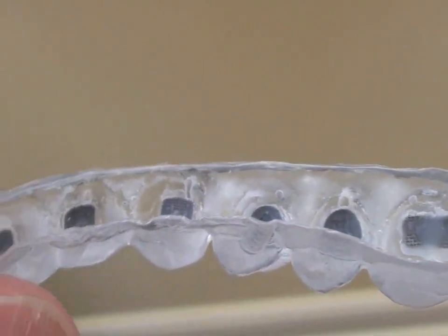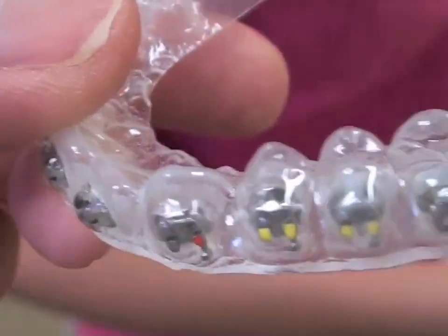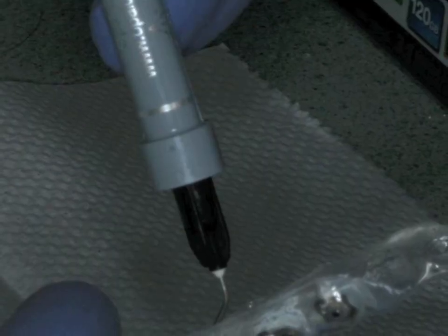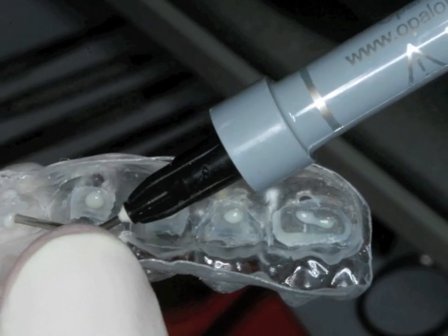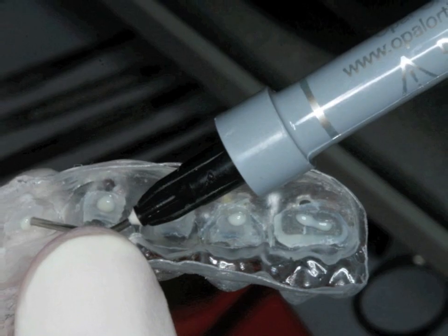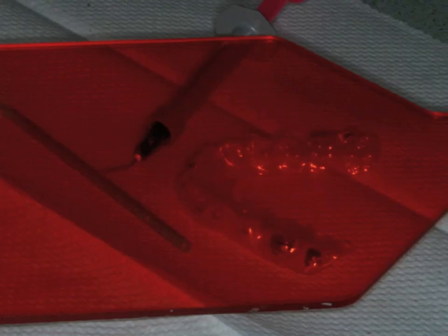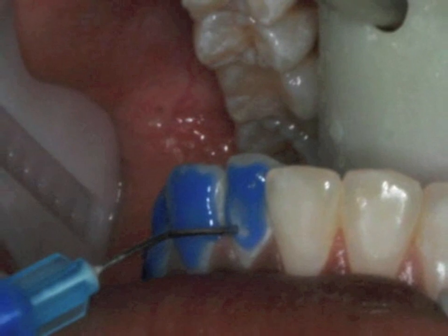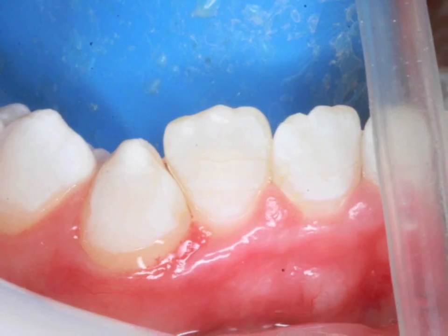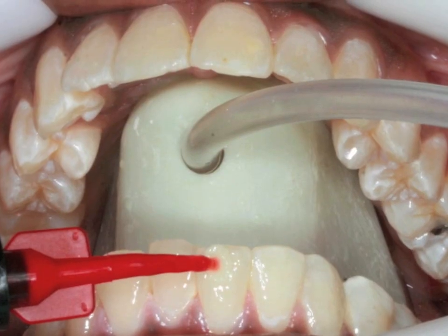After rinsing and drying, the brackets are ready for patient delivery. The brackets are coated with a thin layer of Opal Bond Flow flowable adhesive, then thinned with a micro brush. This final coat should not be done until the patient is seated to prevent ambient light curing, but the light shield is helpful. The entire facial surface of the tooth is etched with Opal Etch, which is self-limiting and does not allow etching too deep.